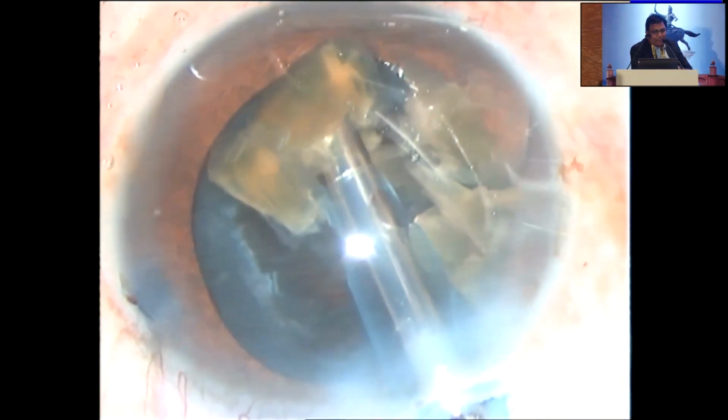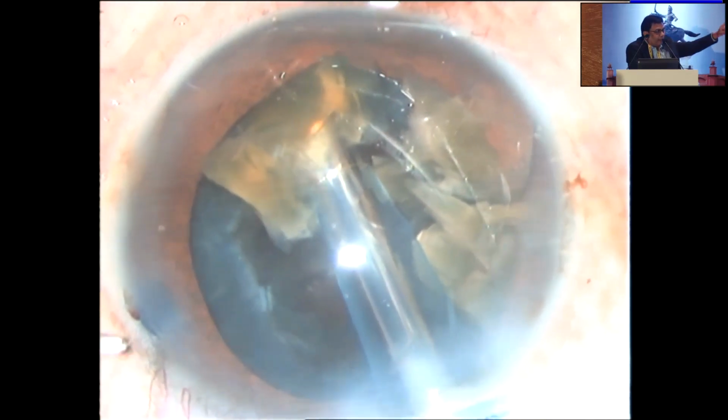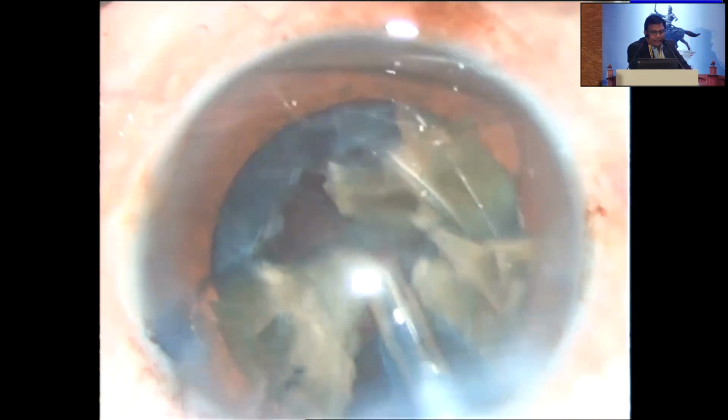Now, this is another slide which I understood after 10 to 12 years of my phaco practice. Now one phaco handpiece is inside. Pieces are not coming clearly. There is a struggle.